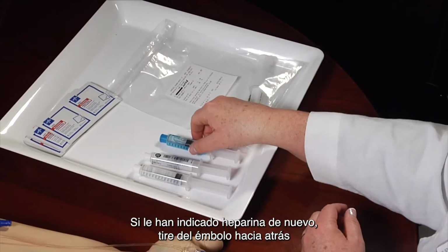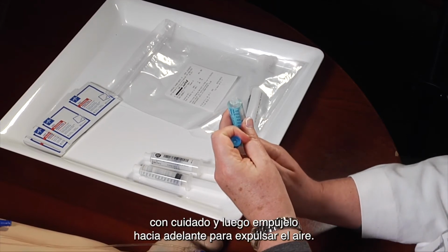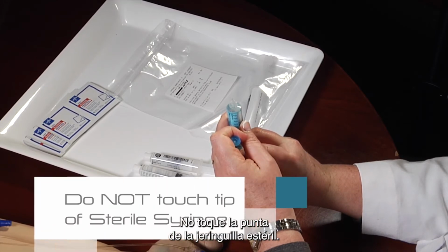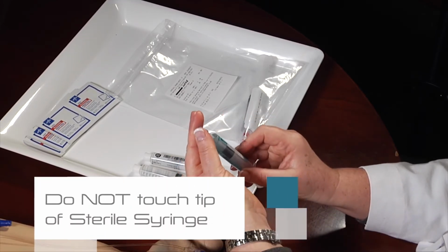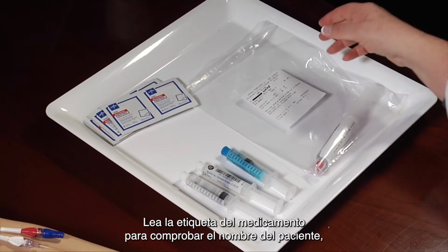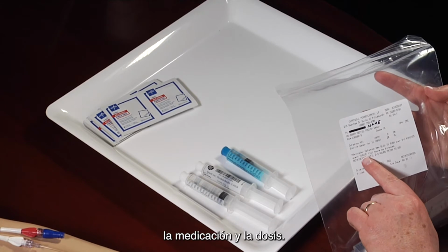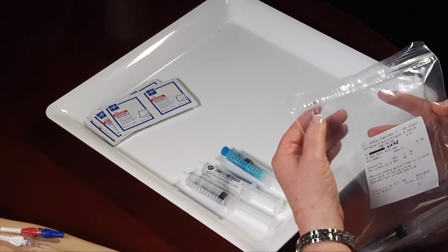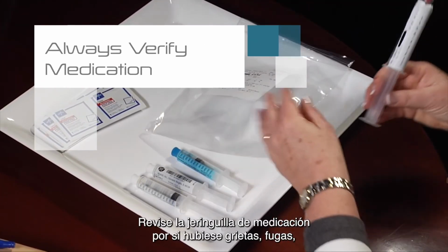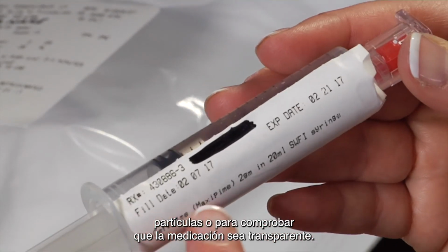And finally, if heparin is indicated, once again gently pull back on the plunger and push gently forward to expel any air that is in the syringe. Do not touch the tip of the sterile syringe. Check the label on the medication for correct patient name, drug, and frequency. Inspect the medication syringe for any cracks, leaks, particulate matter, and for the clarity of the medication.